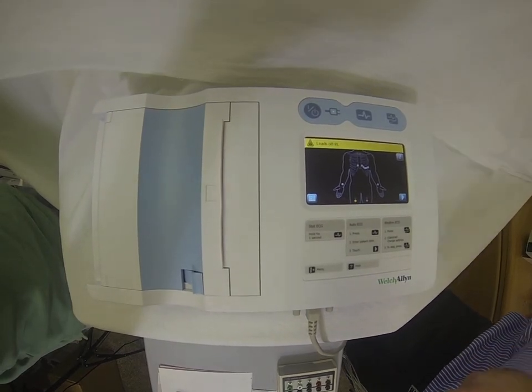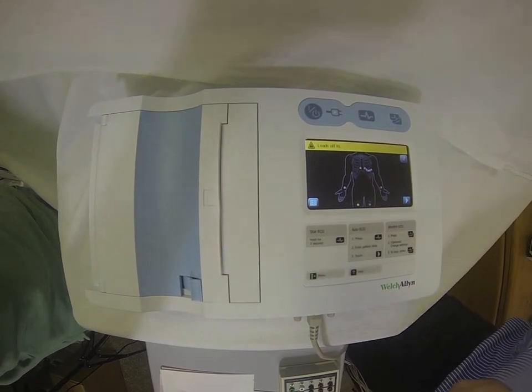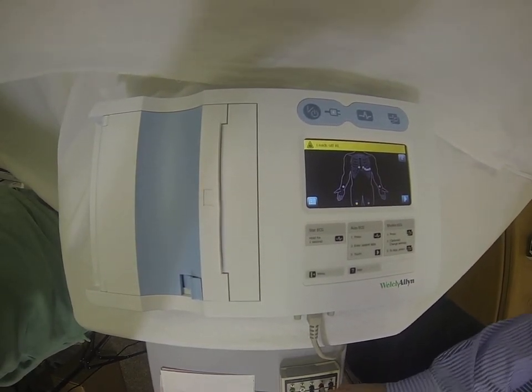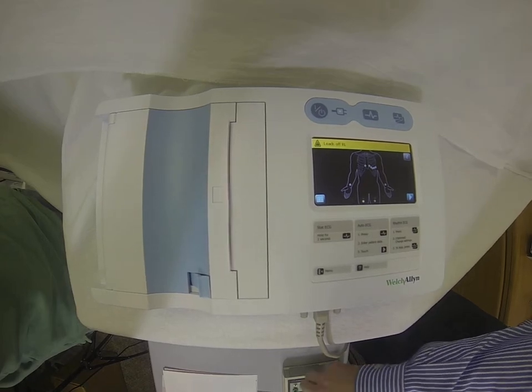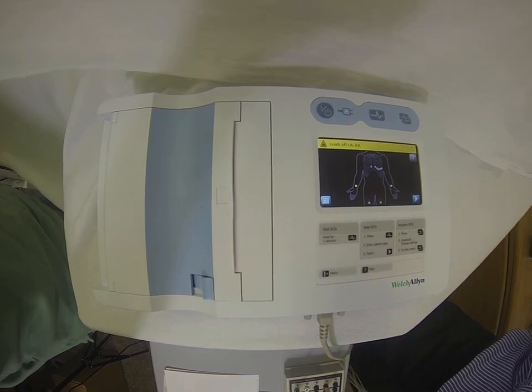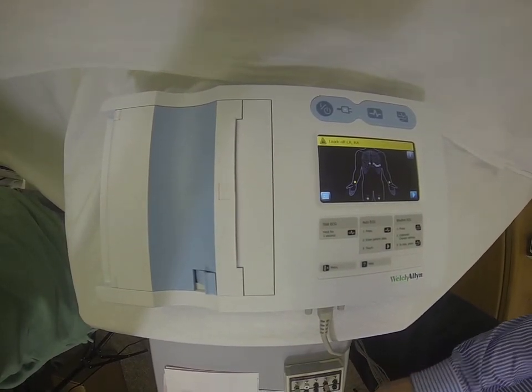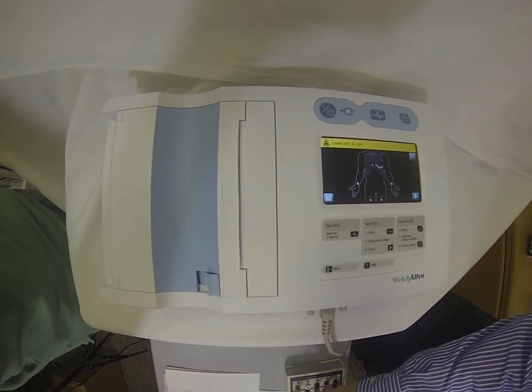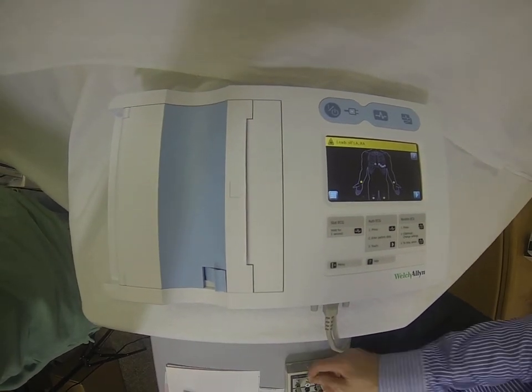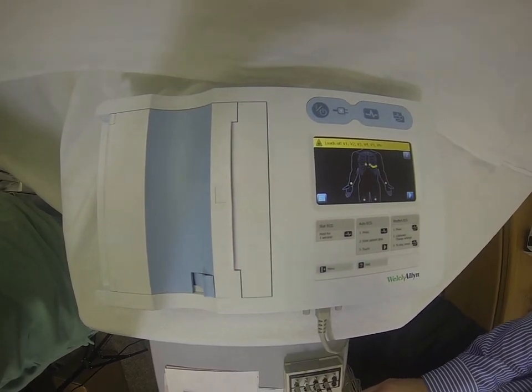It's going to start us with the leg leads, and you'll see the blinking light at the bottom. The reason for that is because the leg leads are what's going to ground the patient. Once the leg leads are connected, it's going to show us next to connect the arm leads. Once they are connected, we will go to the chest leads.